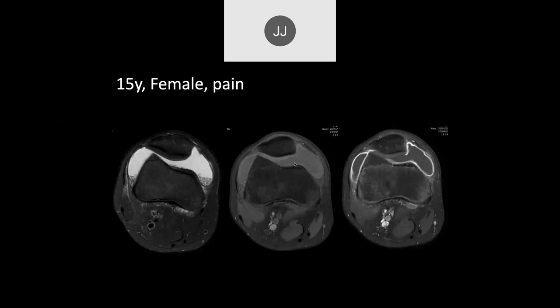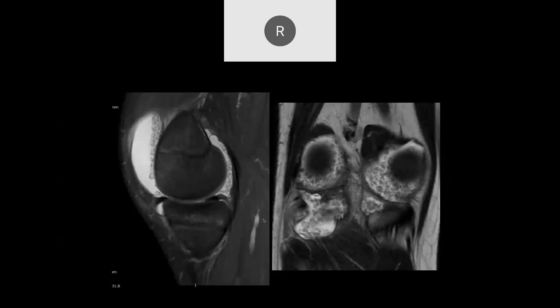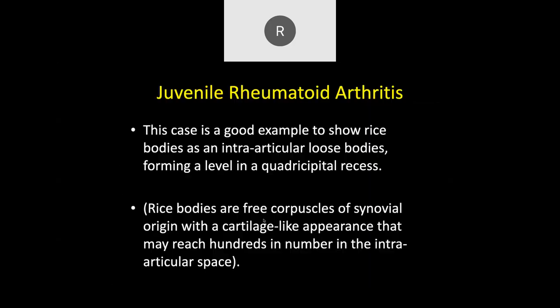In the next case — a 15-year-old with pain — there is a joint effusion with debris laying inferiorly. These are rice bodies, along with synovial enhancement. This is juvenile rheumatoid arthritis with rice bodies inside the joint.